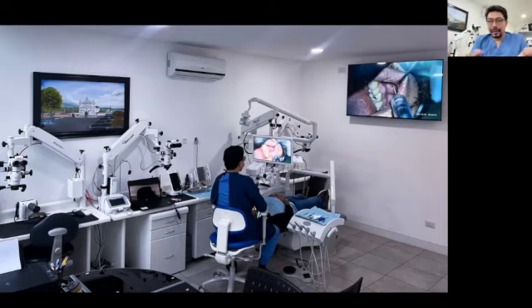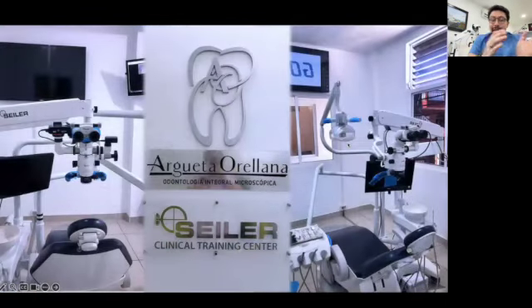You can see the setup in one of our operative rooms. And nowadays, we have already achieved our objective, and every dental chair has a microscope. We do everything under the help of magnification of the microscope. We have 3D microscopes, and we have regular microscopes as well. If we do a prophylaxis, for example, we use the microscope. If we do a surgery, we use the microscope. We do everything under the help of the microscope.